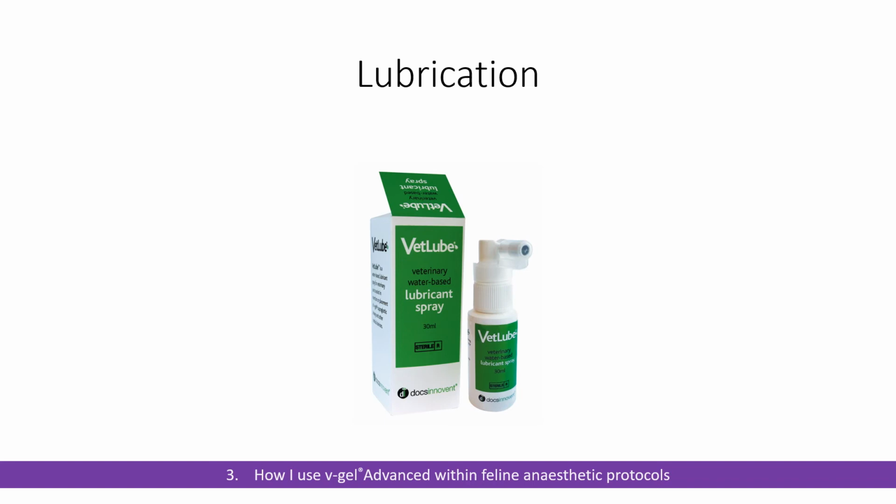The nice thing about the Vet Lube is that it's very quick and easy to cover the large area of the V-gel. You do need to make sure that when you're lubricating a V-gel or a V-gel advanced device, you ensure that the airway channel itself is not being blocked by lubricant, as you would do if you're lubricating an endotracheal tube.